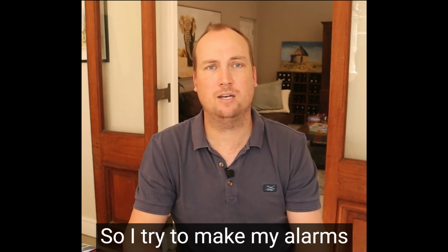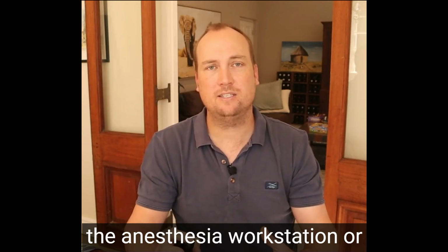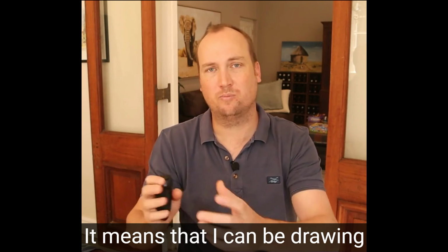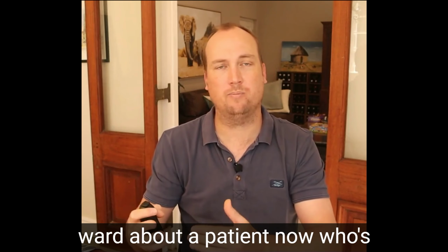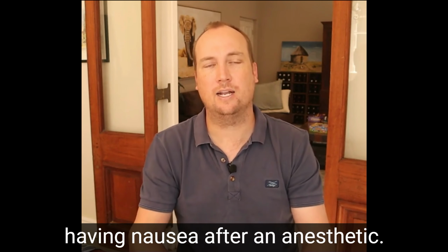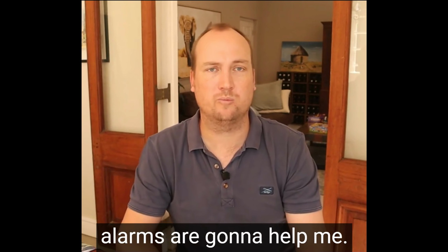So I try to make my alarms more patient-specific, and then the anesthesia workstation or machine can help me do my job. It means that I can be drawing up drugs or writing a script or answering a phone call from the ward about a patient who's having nausea after an anesthetic. And I know that while I'm doing those things and I'm slightly distracted, my alarms are going to help me.